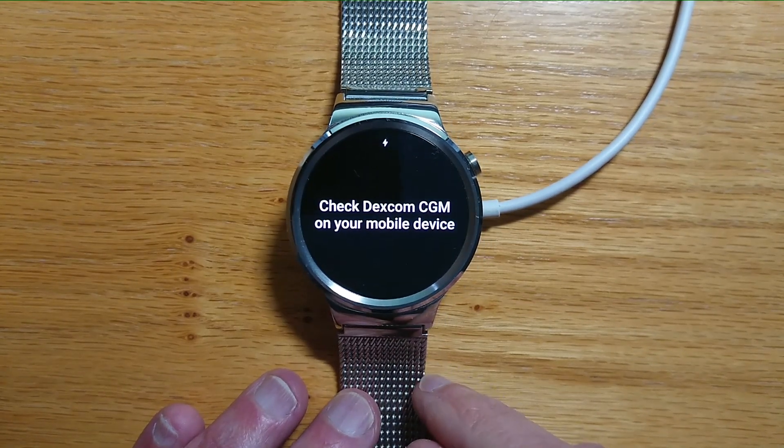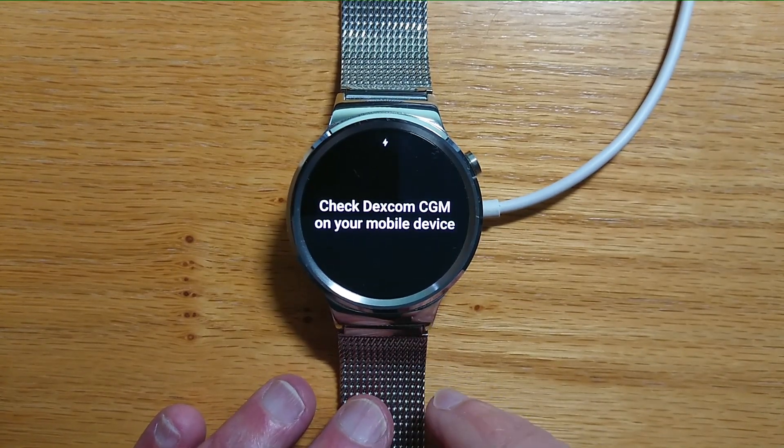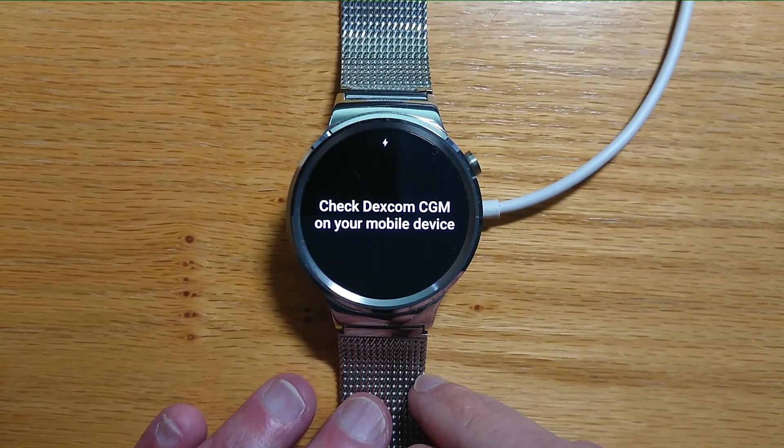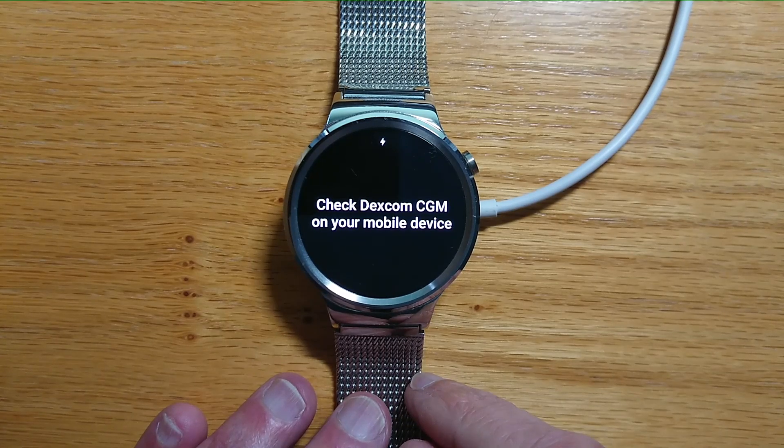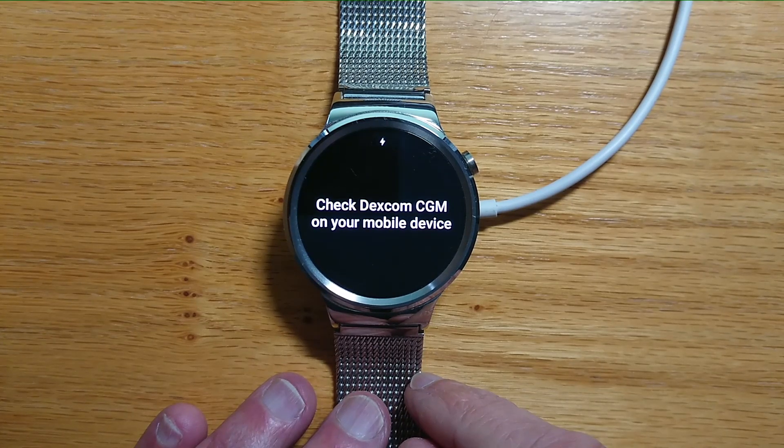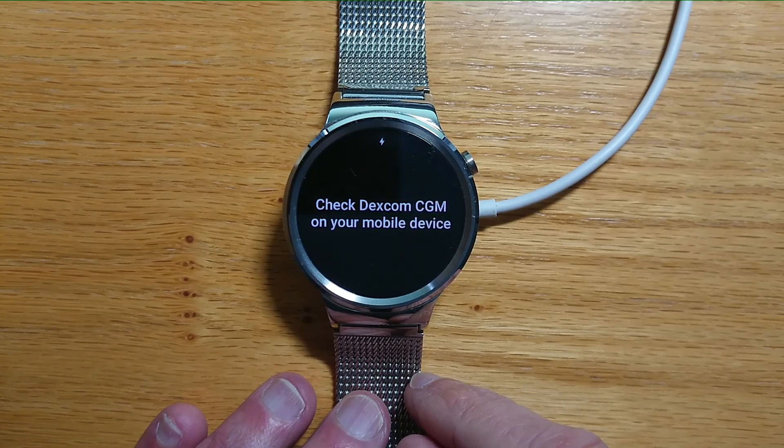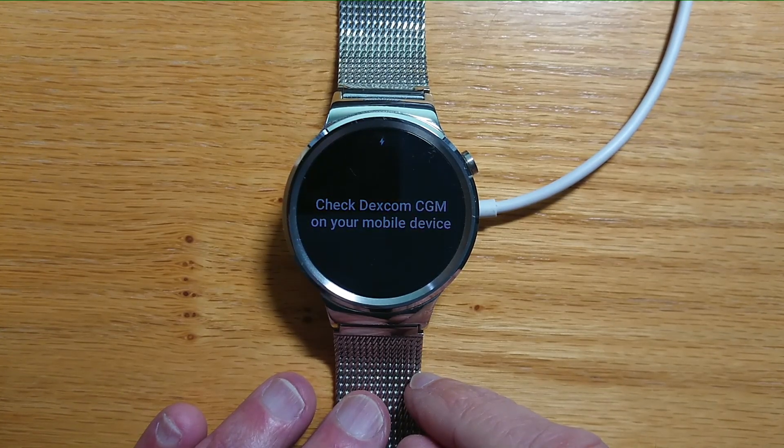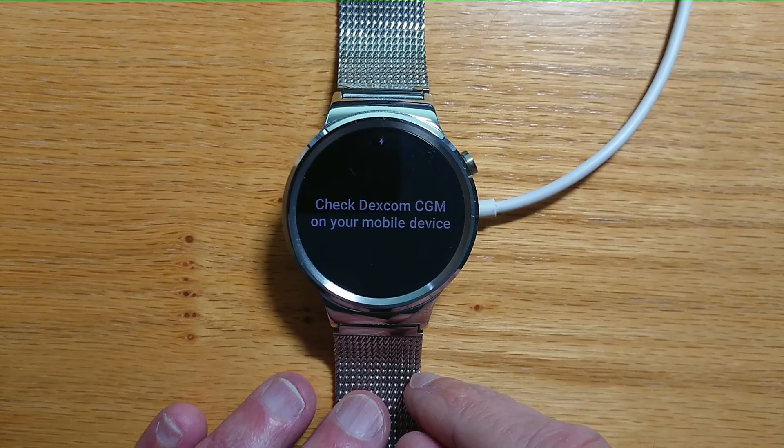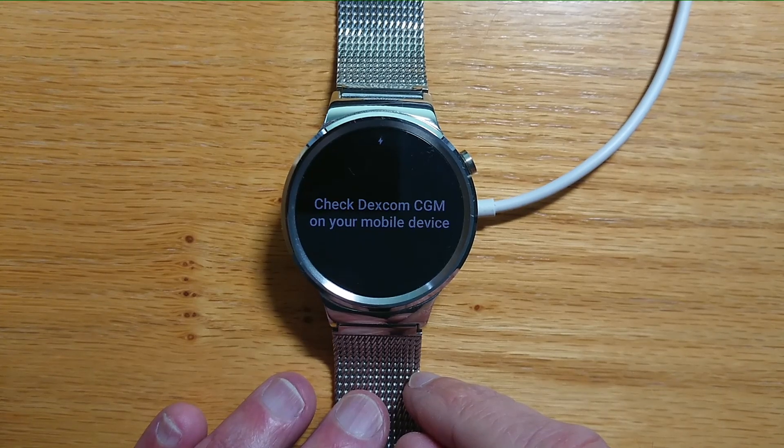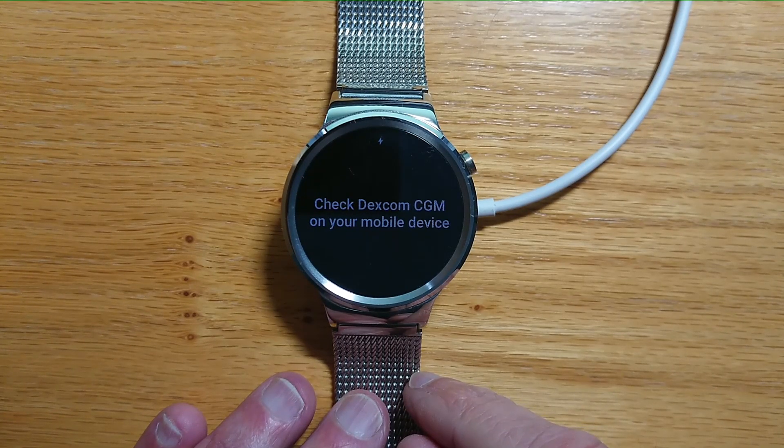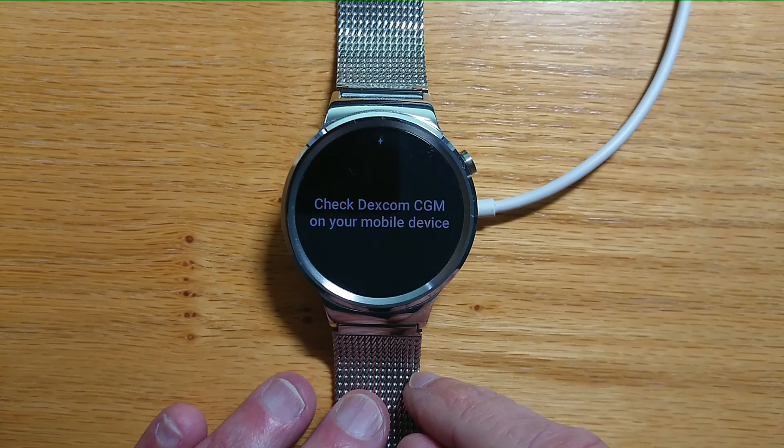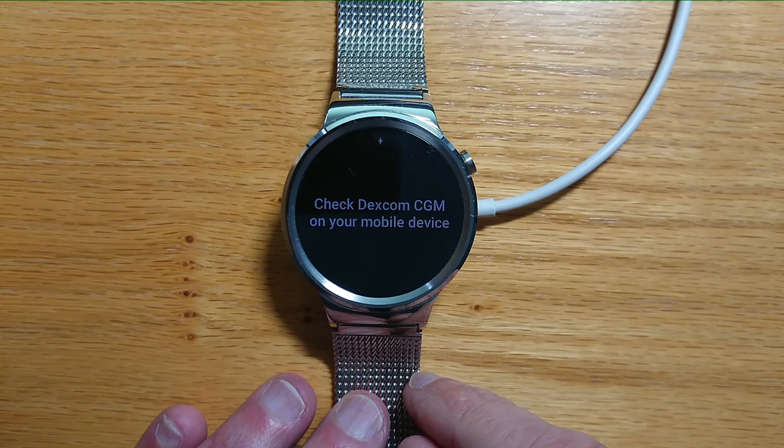Now if you get this message, then just restart your watch and your phone, and hopefully the two devices will find each other and you'll be able to use the Dexcom watch face from there.